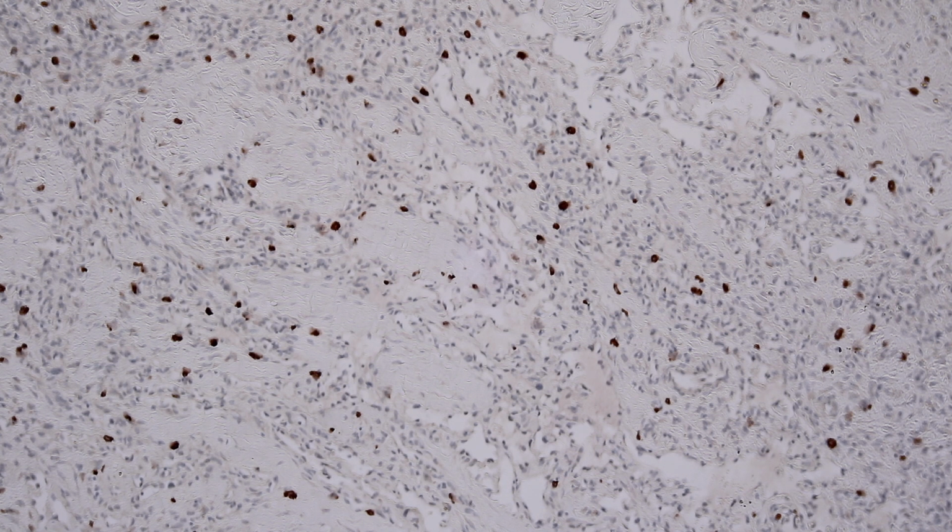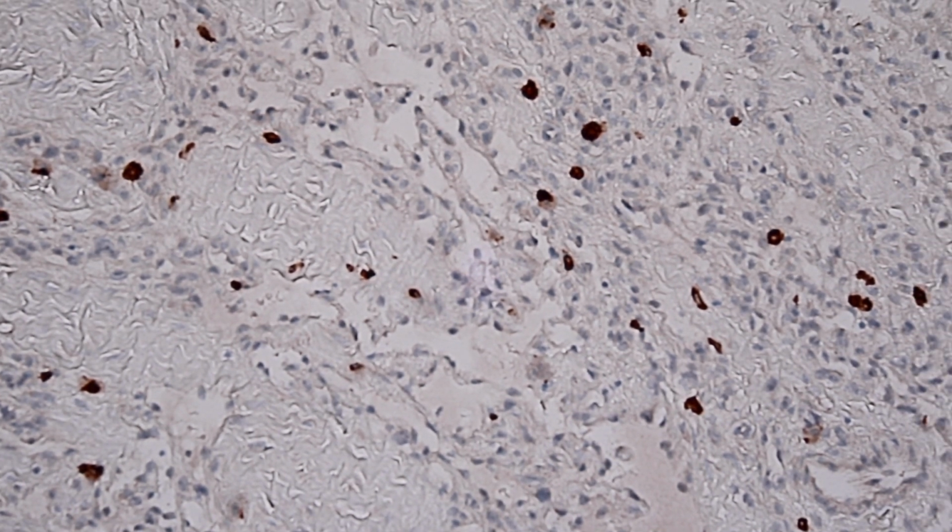When the entire cytoplasm is staining like this from low power, you could imagine that these are big nuclei staining. Because it's such a round shape, you could think this is nuclear staining. So on a myogenin, mast cells in the middle of a tumor, if you didn't look closely, you could mistake that for focal nuclear positivity and mistakenly think something was a rhabdomyosarcoma. Obviously not in this case, because it's clearly a vascular lesion. But the point is to keep in mind that some of those stains do that.